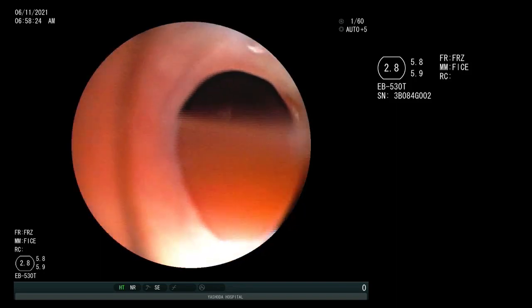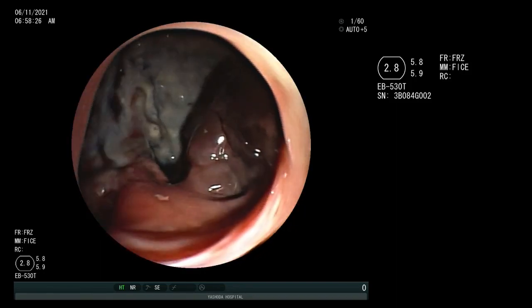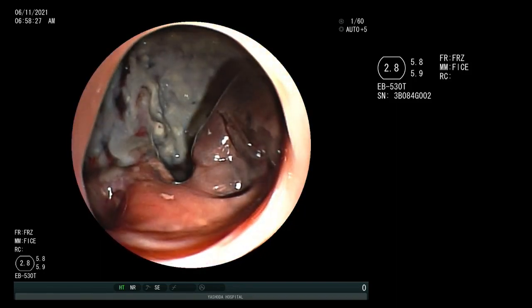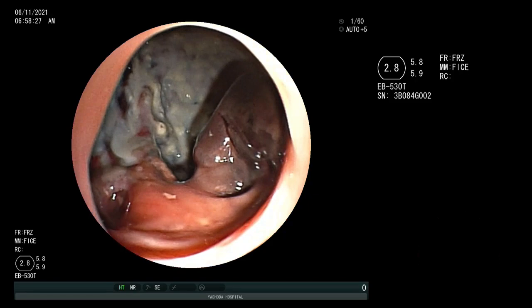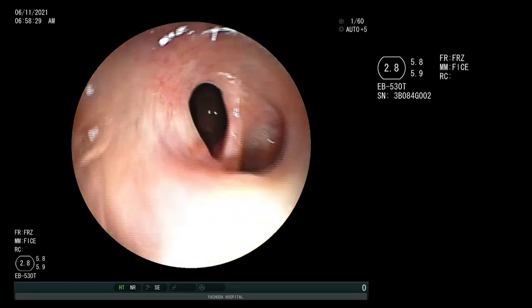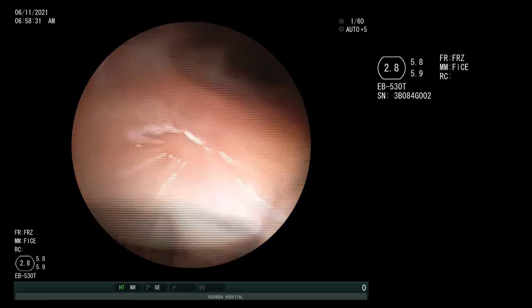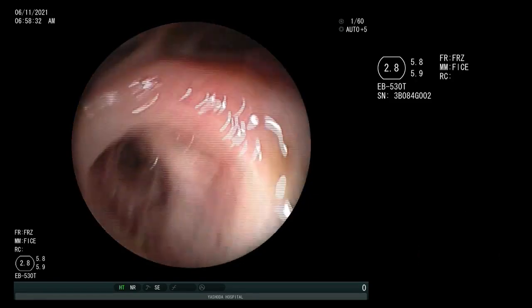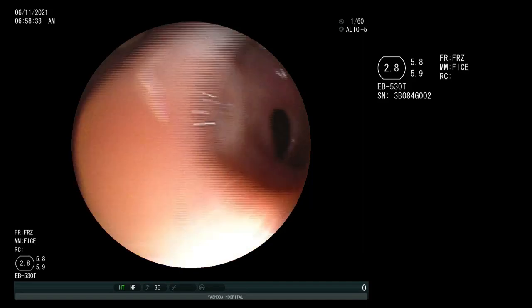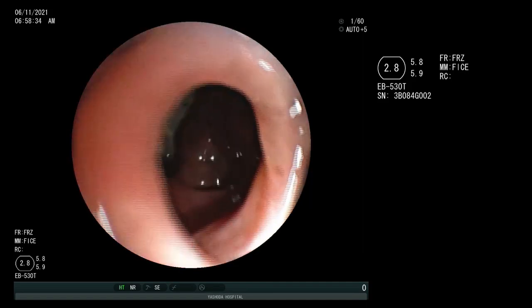Endobronchial spigot placement with a flexible bronchoscope was done as a bridge to surgery following medical management. The video explains the procedure in short.